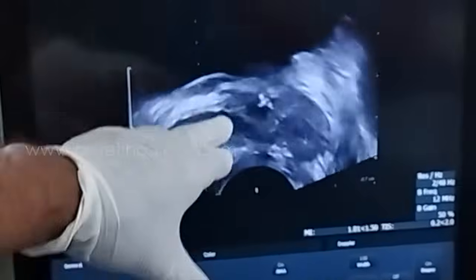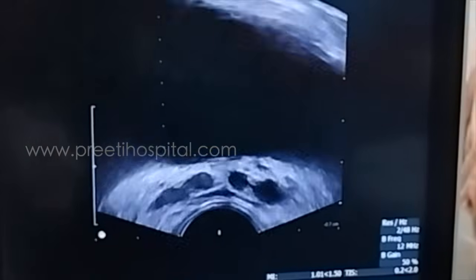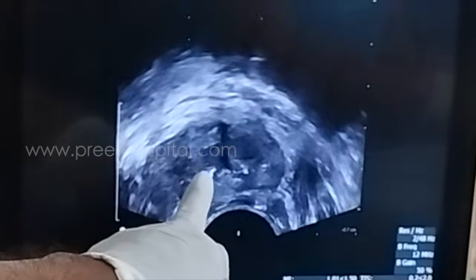Yes, exactly. You come back. This is the urethra. This is the seminal vesicles. Come back in the same center. This is the prostate, this is the urethra. This is a pure axial cut. Come back, come back.